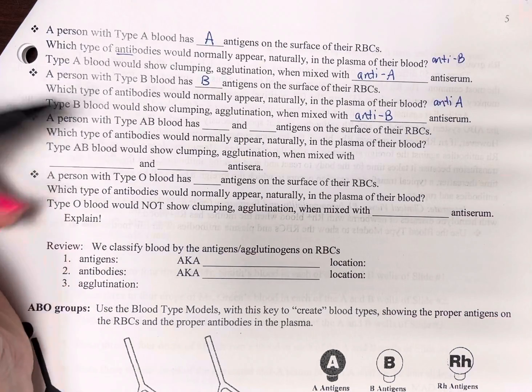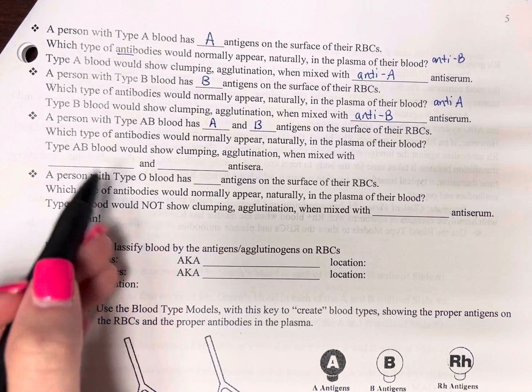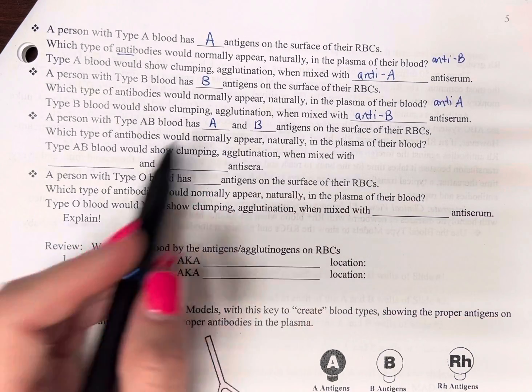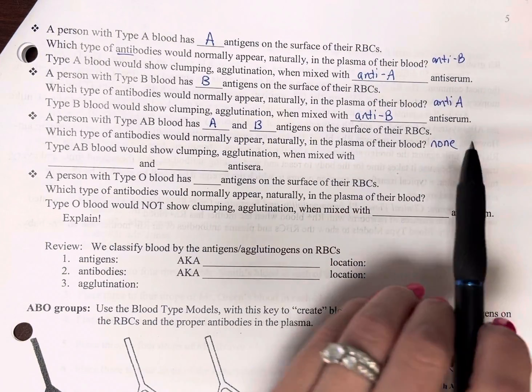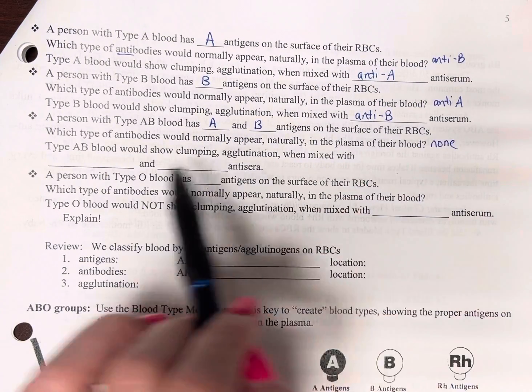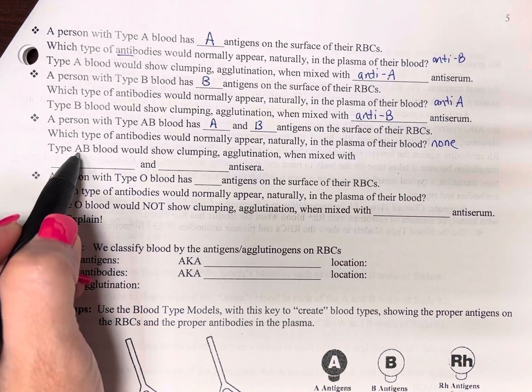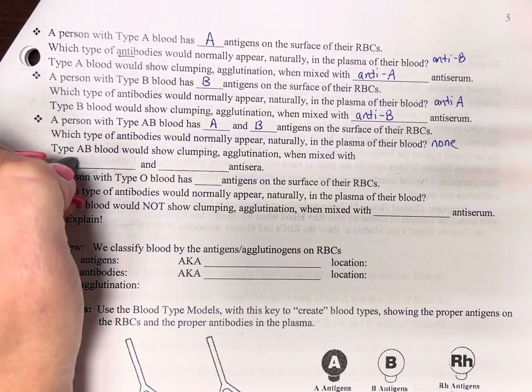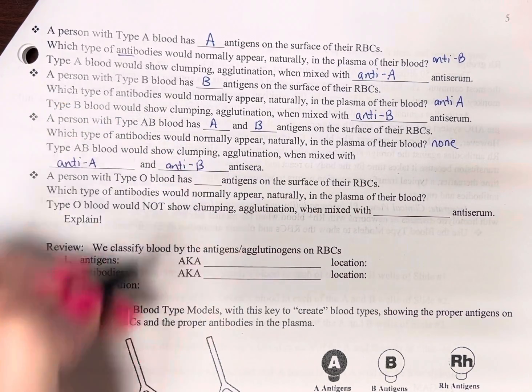Somebody with AB blood has both A and B. So in this case, they are not going to have any antibodies, because if they had anti-A or anti-B, they would react with themselves, and that would be bad. So AB blood clumps with both anti-A and anti-B.